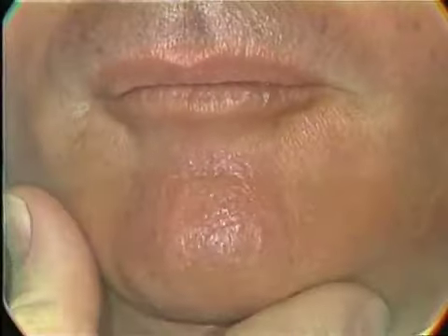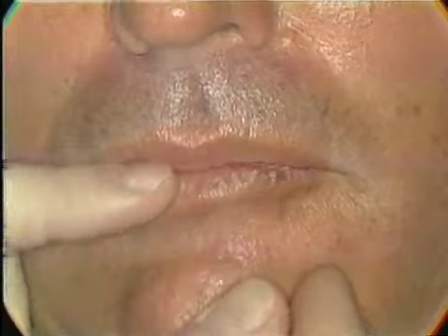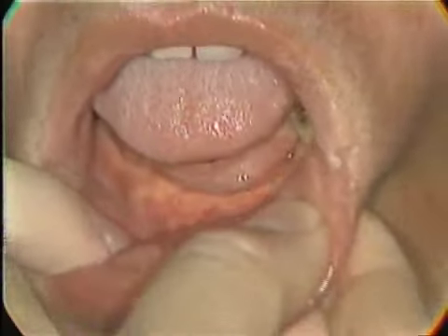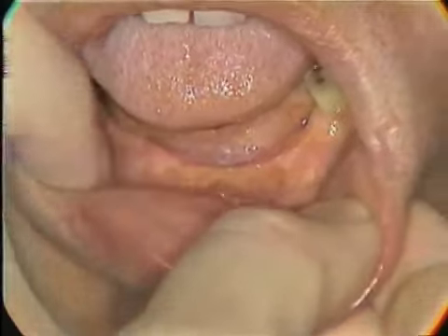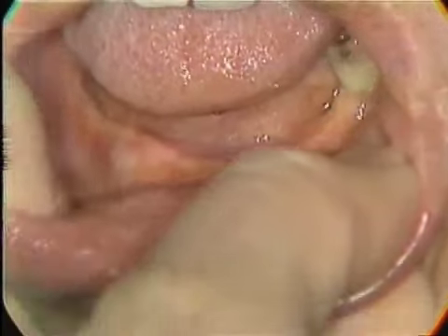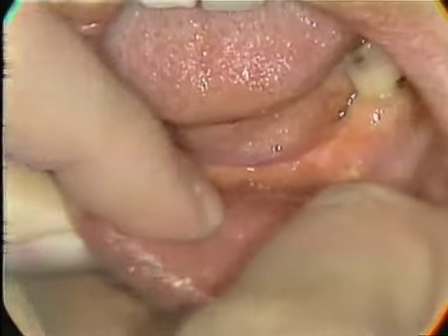So close. We'd want this patient's tissues in a rest position when we take the impression. If we pull on the tissues, put our fingers in the mouth, we can distort this peripheral tissue, as you can see here. Notice the change in the peripheral tissues as we move or manipulate this tissue.